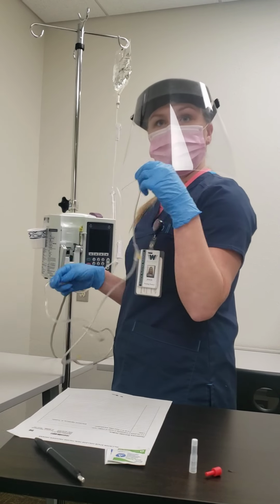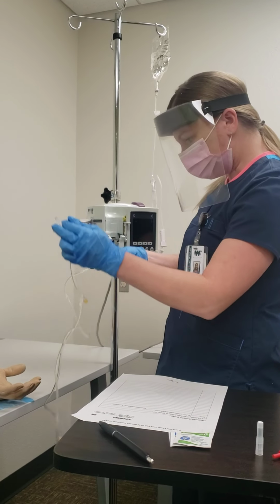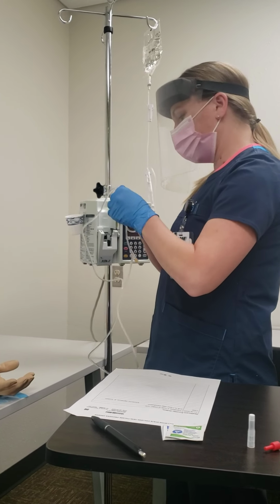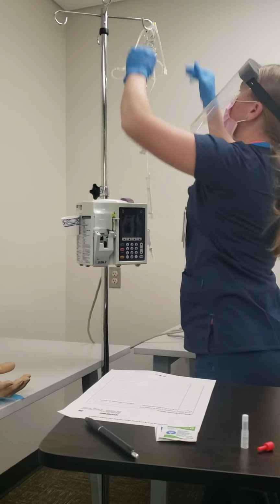Okay, I want to make sure to keep this sterile. Okay, and there's no bubbles in my line, so that looks good. I'm going to go ahead and recap and put this up here just so that it can stay sterile and not dirty.